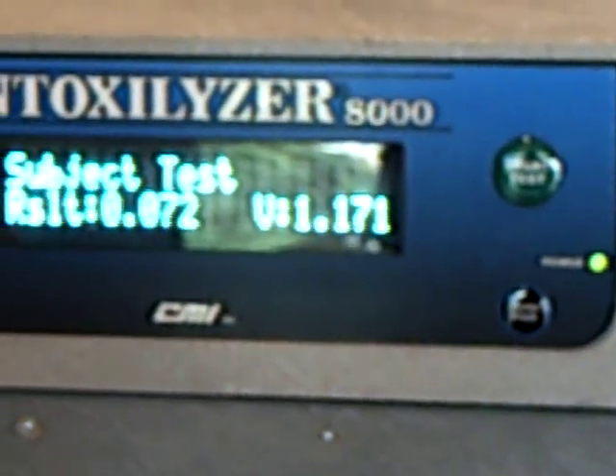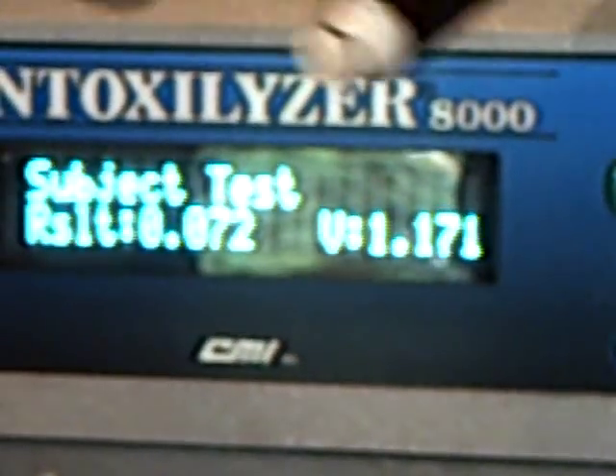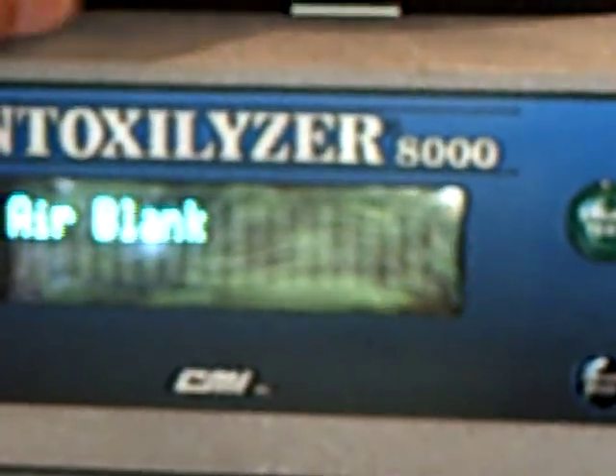There you go. I just blew a 0.072 on beer — I rinsed my mouth with beer. I had a sufficient sample. That's the demonstration. It's showing you how this machine has problems distinguishing true mouth alcohol from breath alcohol. You saw me first blow into the machine to show I had no mouth alcohol, then saw me rinse my mouth with Corona, recycle the machine, and blow a 0.072 with sufficient volume.